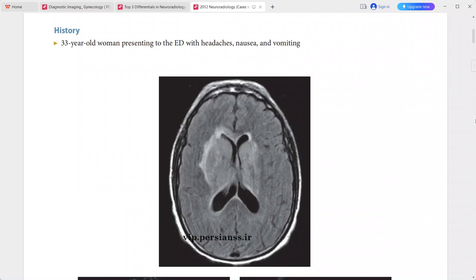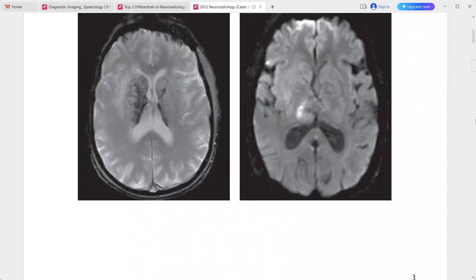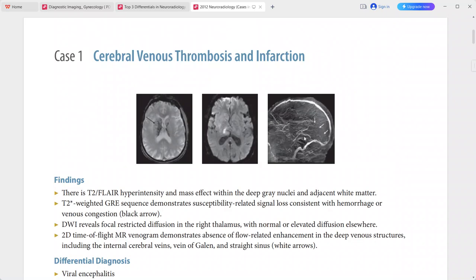The GRE T2-star sequence shows susceptibility-related signal loss, consistent with hemorrhage or venous congestion. The DWI reveals focal restricted diffusion in the right thalamus with normal or elevated diffusion elsewhere.